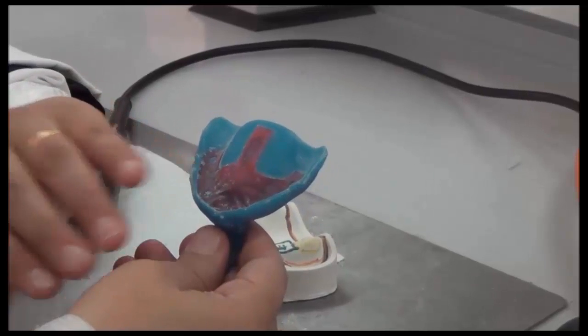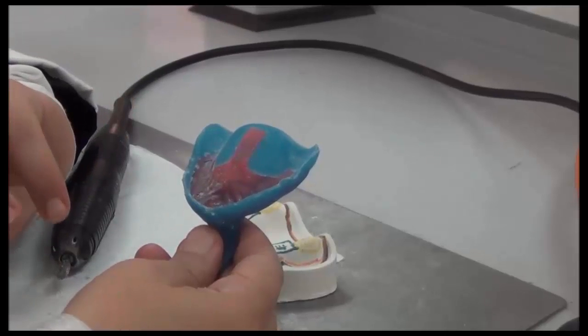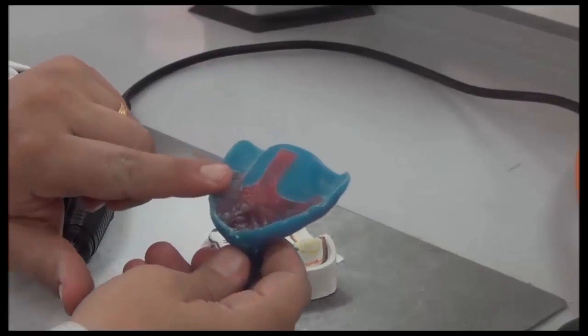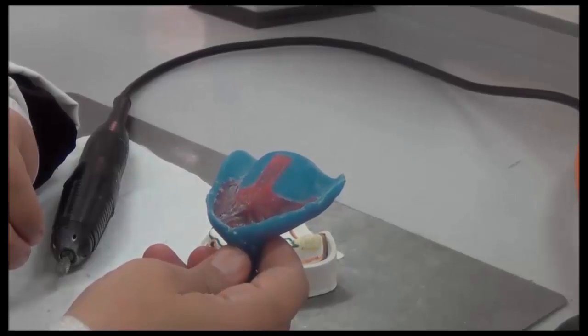You're going to finish the upper tray only. And for the lower tray, it's just for you to put in the holes before you cure, and you're going to train on that. But the submission will be on the upper tray. So you're free now to go in and begin working with your tray.